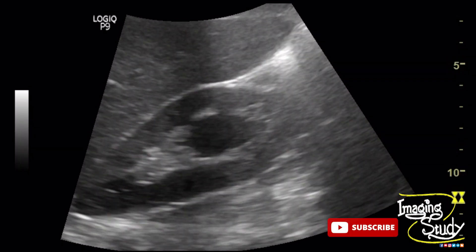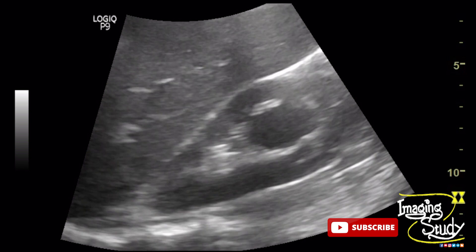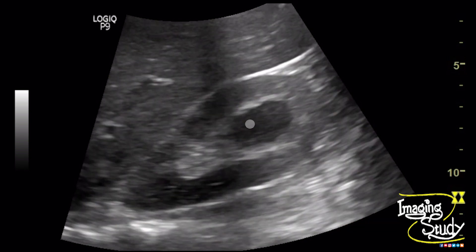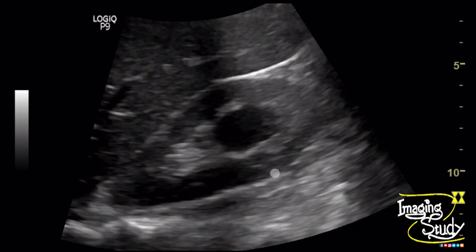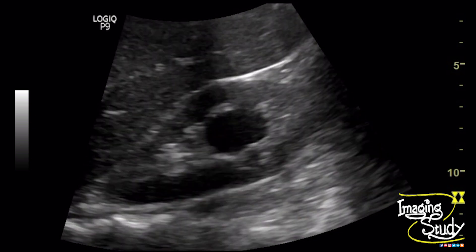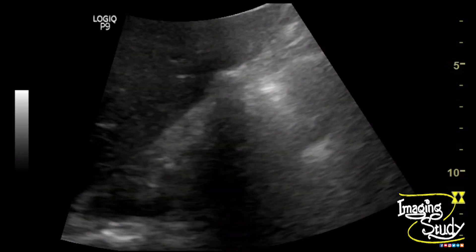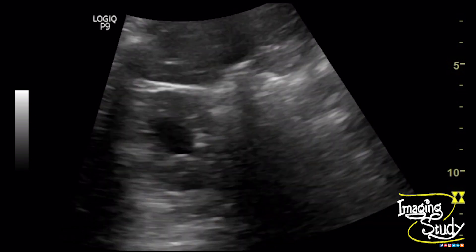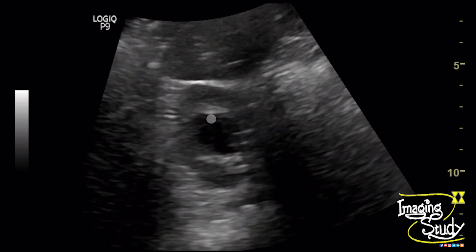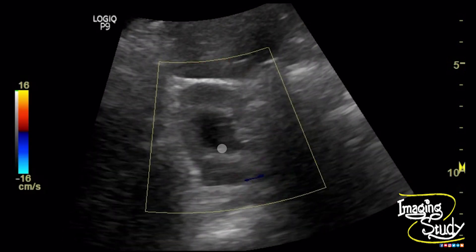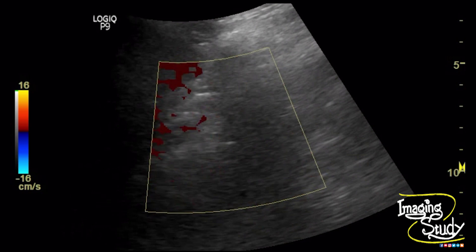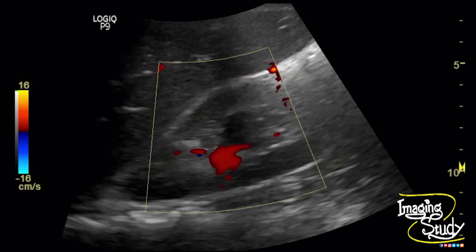Here on a magnified view of the longitudinal section of the right kidney, a round to oval anechoic cystic structure is seen at the lower pole of the renal pelvis. You can also see that structure at the central part of the kidney on transverse section. Color Doppler shows no internal vascularity, which excludes the chance of a solid component within it.